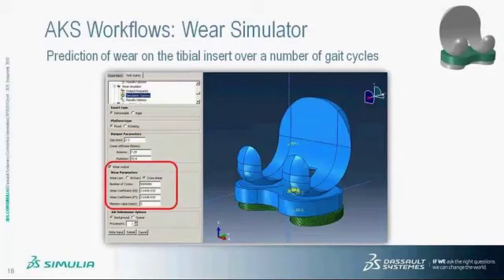Two wear algorithms are provided for this workflow that include the more established Archard's Law wear algorithm, which is the isotropic wear. We also provide the latest research results, which is the cross-shear wear algorithm. Here, the change of direction between the femur and the components in terms of contact slip accelerates the wear between the femur and the tibial components.